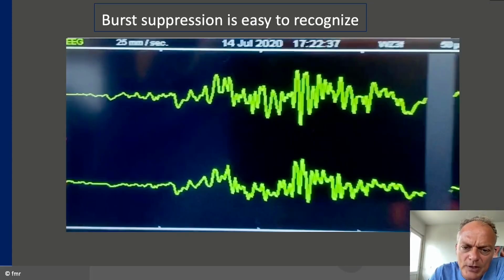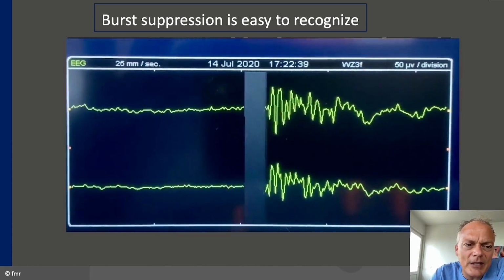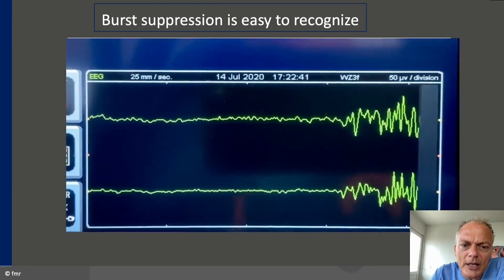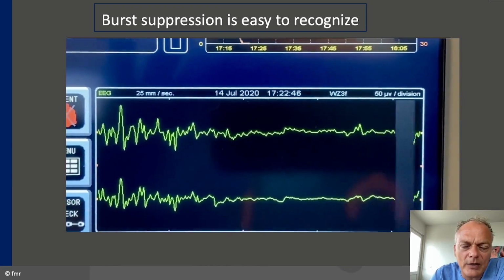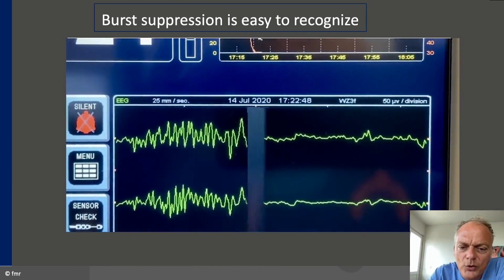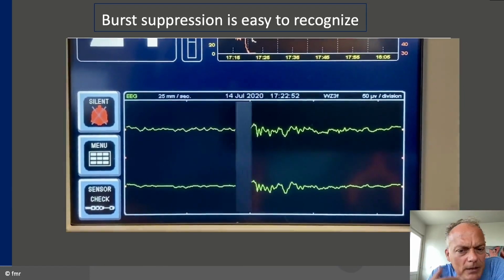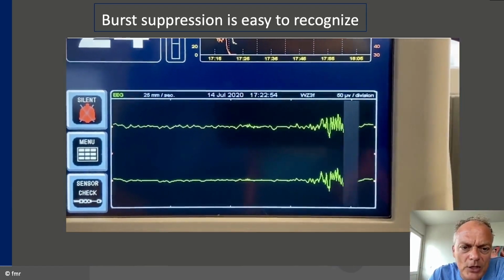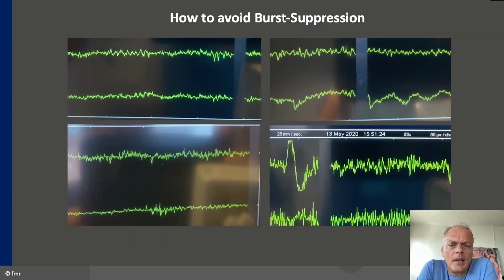And burst suppression is, again, very easy to recognize in the clinical routine. When you induce your patient and look at the raw EEG, you can easily recognize it. It's these isoelectric phases in interchange with alpha-dominant bursts, followed by isoelectric phases. If you see this, you have generally speaking over-titrated your patient. Easy to recognize. You don't need to be an EEG specialist to see that, and to adjust your anesthesia accordingly.